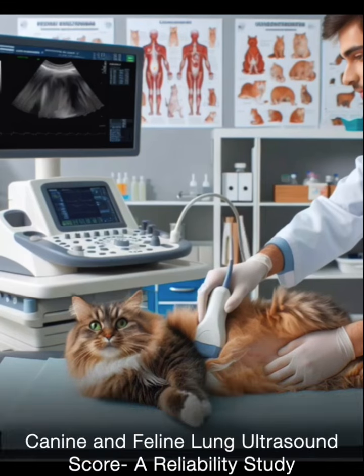Traditionally, qualitative lung ultrasound has involved a subjective characterization of the lung based on the identification of artifacts, analysis of the pleura, and visualization of other abnormalities like pleural effusion or consolidations. This qualitative approach helps in determining the underlying cause of acute respiratory distress. However, the researchers point out that a quantitative approach can be particularly helpful in monitoring patients during treatment.